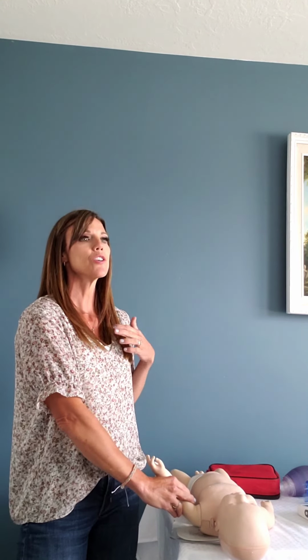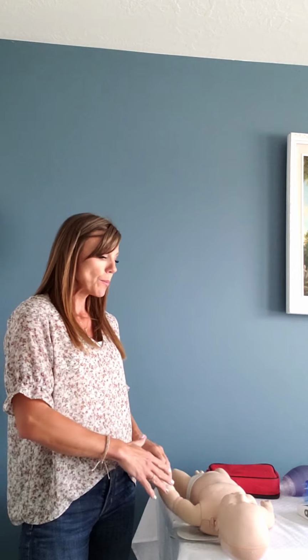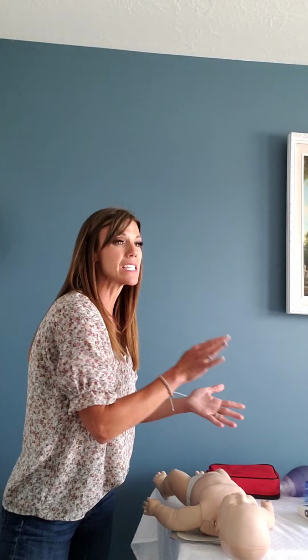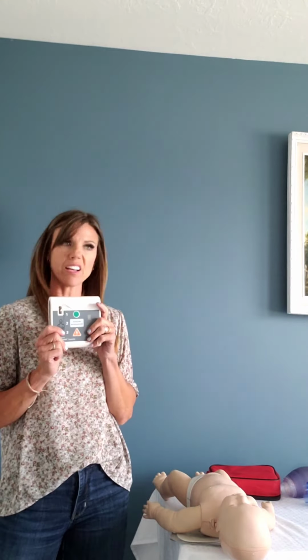If you feel one, you're like, oh, there's a pulse, yay, you brought them back. You still need to stabilize them, make sure they're okay, and send them to the hospital, send them to the ER. They still need help. But it is important to make sure, if it's not shockable, see if there's a pulse. If you don't feel a pulse, they're still dead. They still need CPR. They still need help. But shocking them, the defibrillator is not going to help.